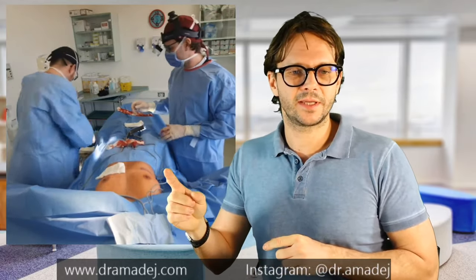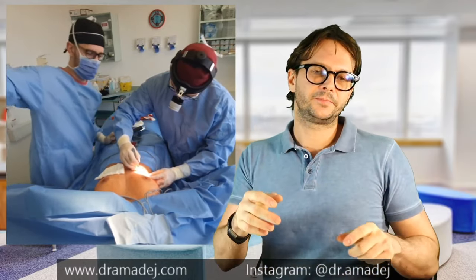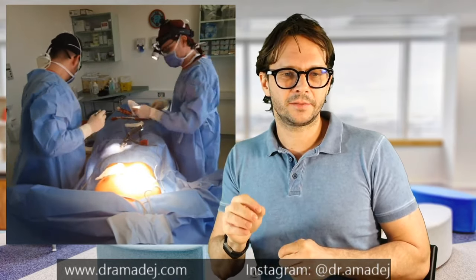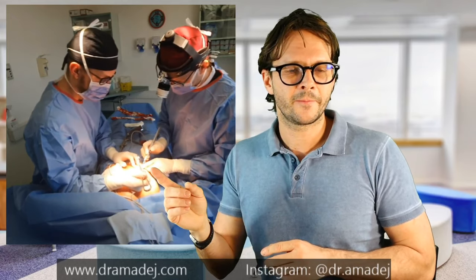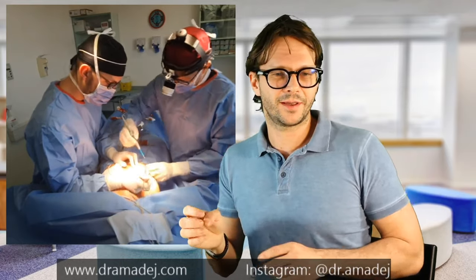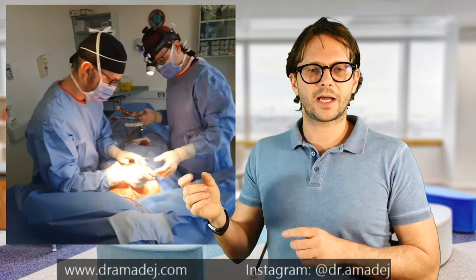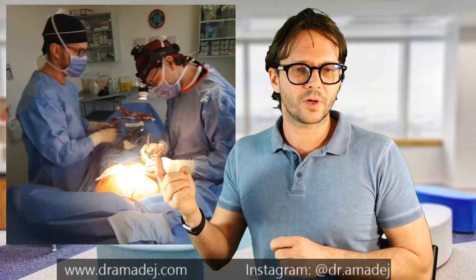One side is done — now we do the same thing on the right side. Again, as you can see: skin incision, then continuing work under the skin using the electrocautery knife. My assistant is helping me with the hook so I can see better. We are now at about half of the procedure — this is more or less 10 minutes of work.